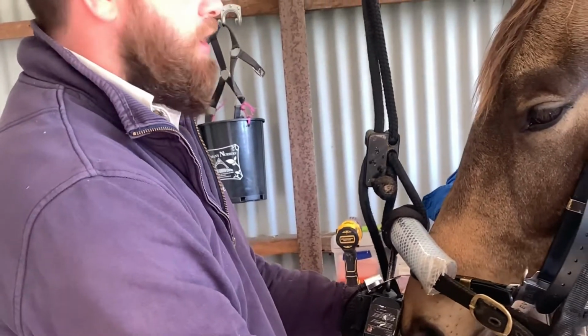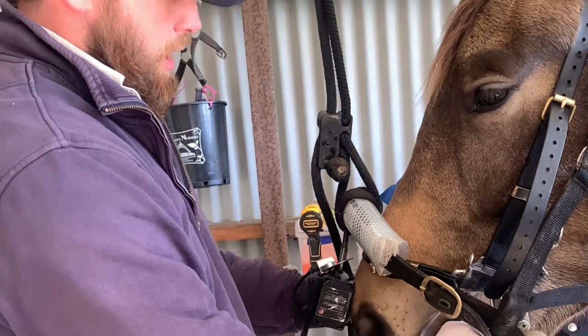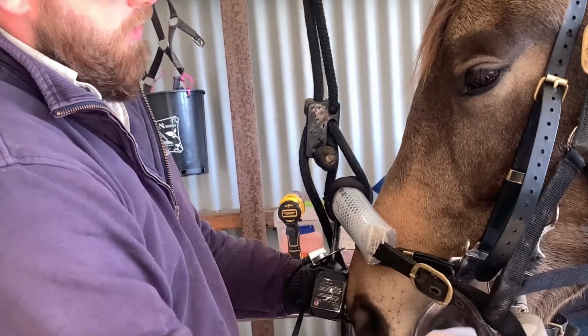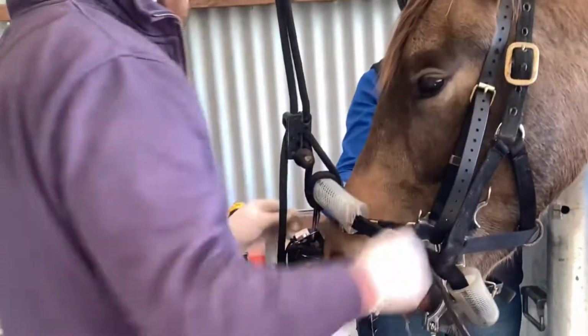So we're sort of paying attention to all of that as we're going along, just to make sure that we're not going to miss anything. Sometimes it takes several flushes to get all this food out too. So just give him a good little hose out. And we might have to do that again, but we'll just have a little look-see.